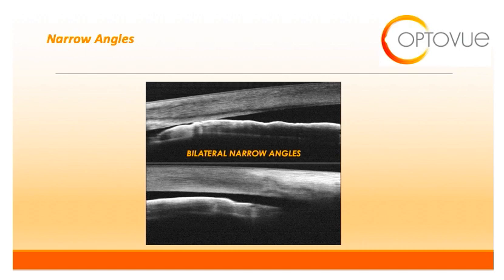On this slide, you can see what a narrow angle looks like on OCT. You can see the anterior placement of the ciliary body in apposition to the cornea. The angle here is completely closed off, as we're not able to put calipers in to measure the distance between these two structures. I hope that you found this webinar useful on how you can maximally utilize your OCT in the assessment of various anterior chamber structures, including the cornea. I look forward to seeing you at future webinars.